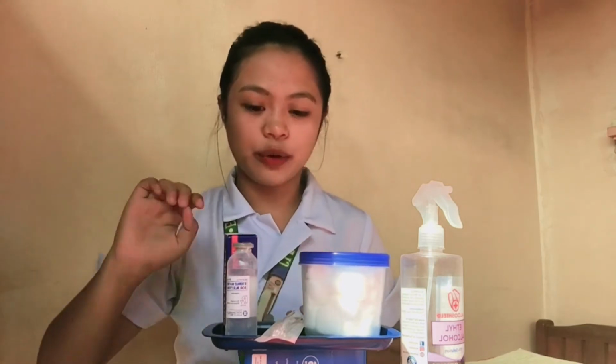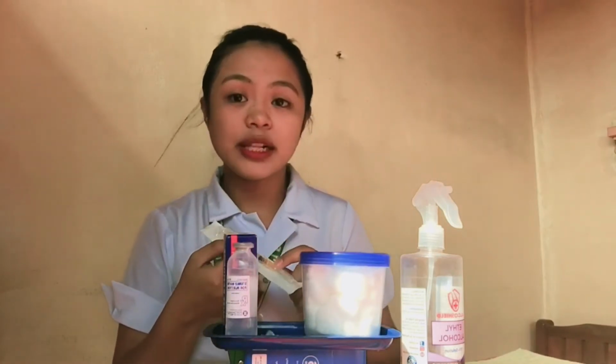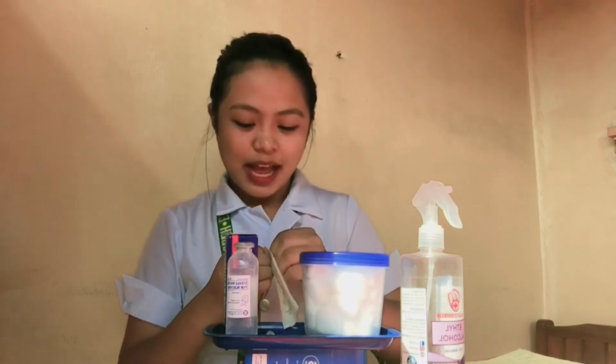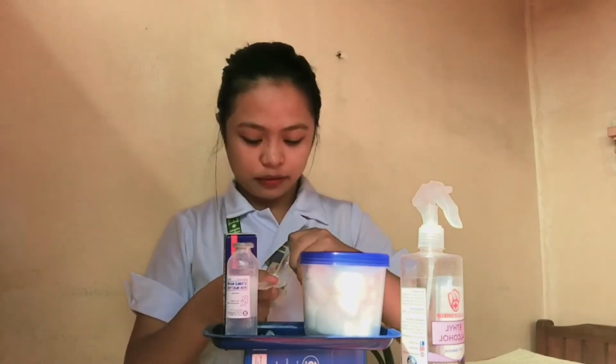Okay, so after preparing the things that we will need, we will proceed to the preparation of the medication. We will withdraw our medication from the sterile water. But before that, we will prepare our syringe. We will remove the original needle and replace it with the aspirating needle.